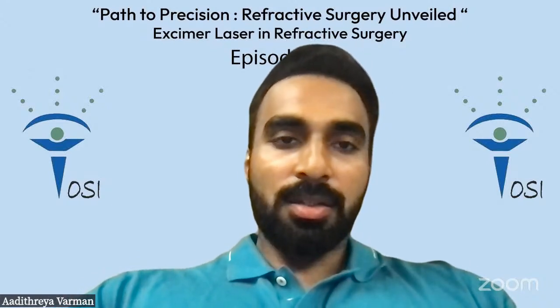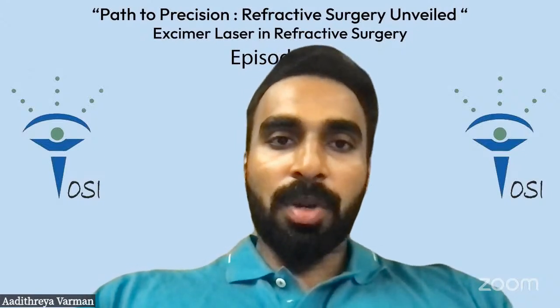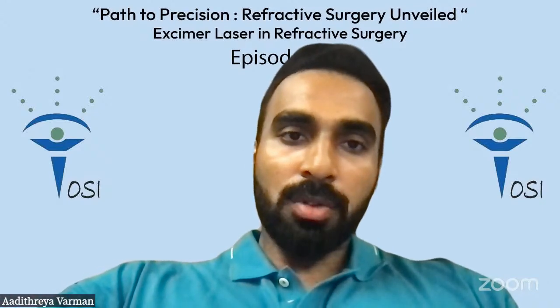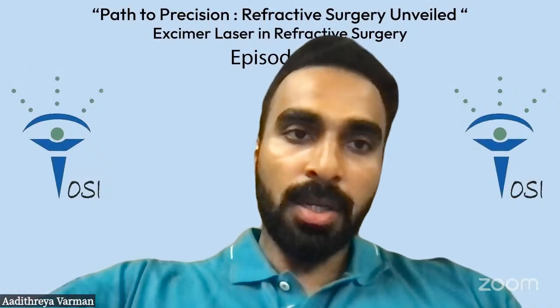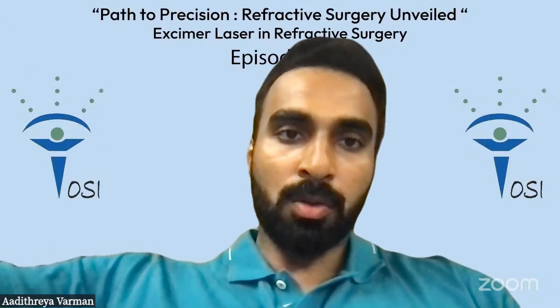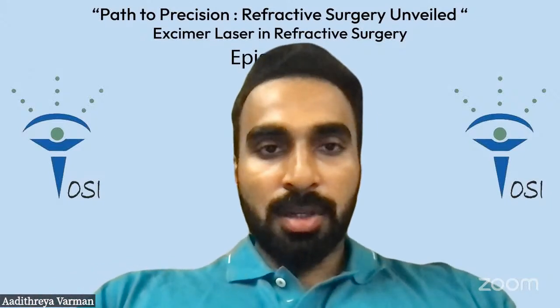Then I stain very hard with the fluorescein, and then you look for microfolds. You'll be surprised that you can iron these microfolds out with just a Merocel sponge. You just do radial strokes from the center to the periphery. You can iron out those microfolds. And then the next day we do it again. So this is the three-step protocol.